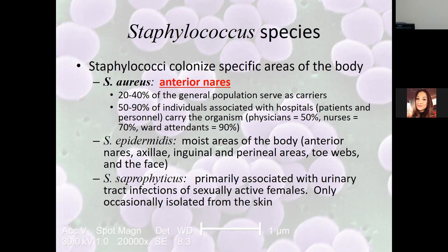Everybody's drawing blood cultures downstairs for principles, phlebotomy. That's the one we worry most about with blood cultures, getting that one in the bottles, because that's not really what we want. This could be your source of contamination on a blood culture draw. It's the reason you have to scrub it down and put chlorhexidine on that and all that good stuff before you stick. And the reason why, if you miss, you have to start all over, because you just introduced the skin to that side of it.